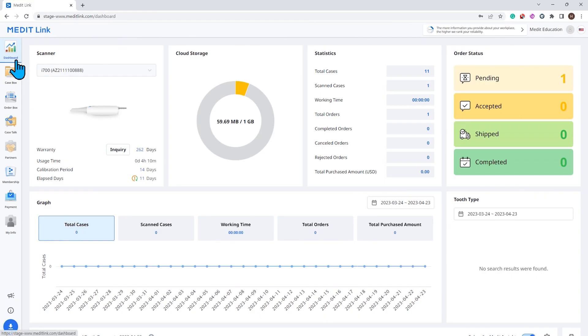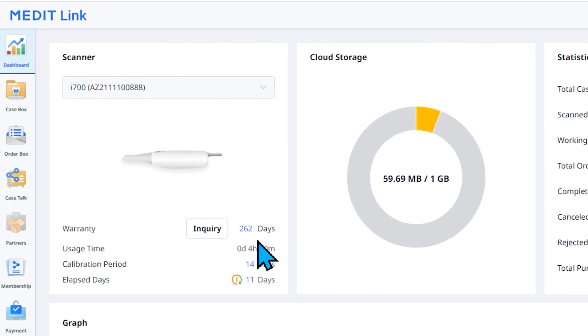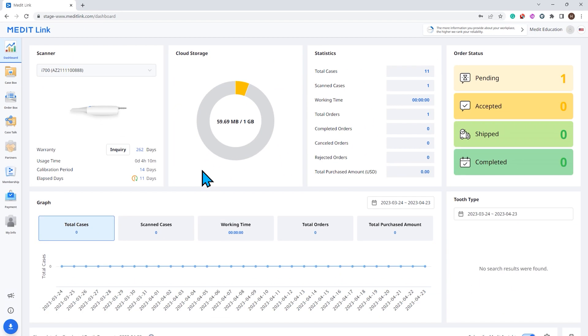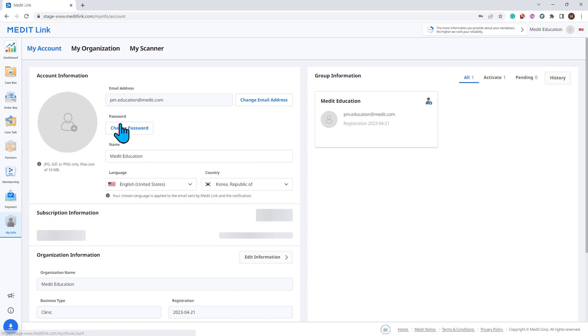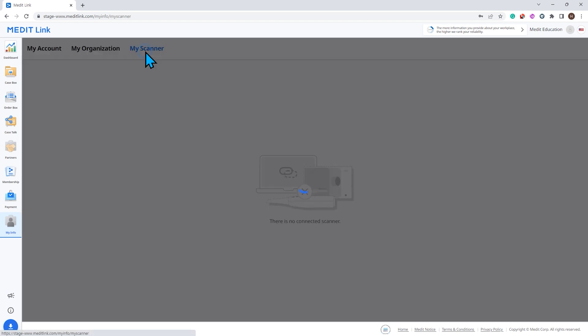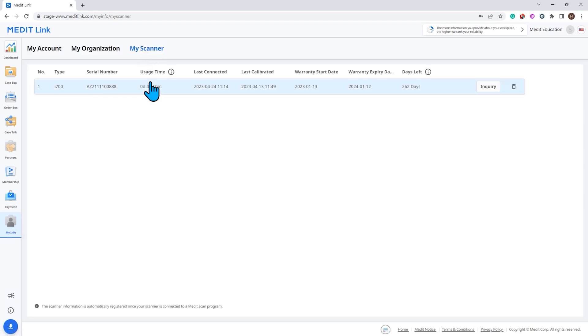And finally, you can now check the details of your scanner's warranty in MeditLink. Go to the Dashboard or My Scanners section in My Info to check the remaining days of the warranty.